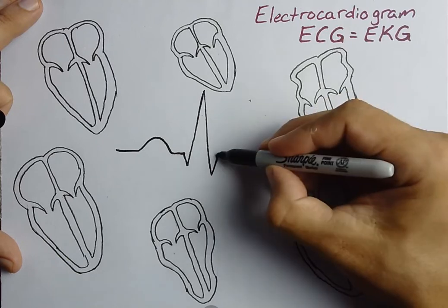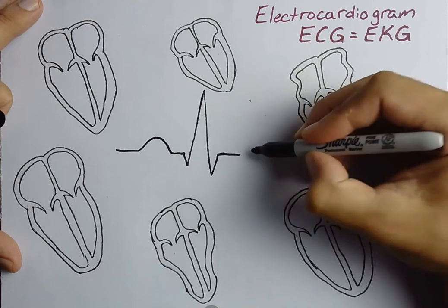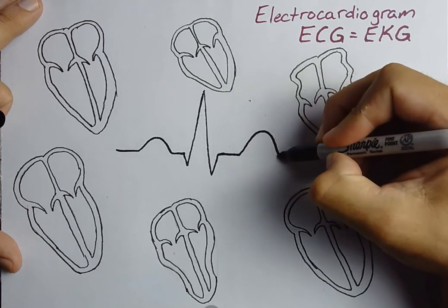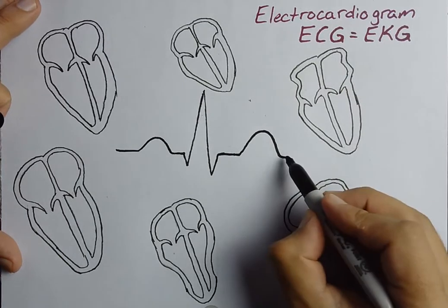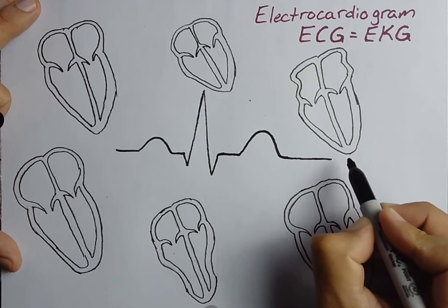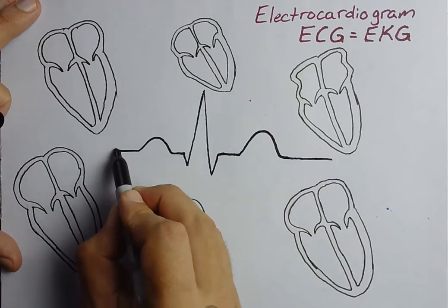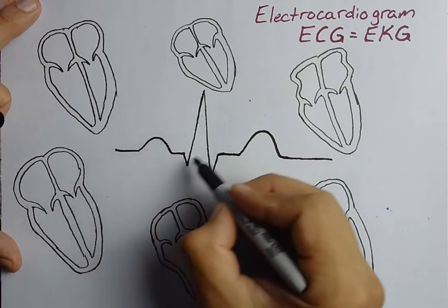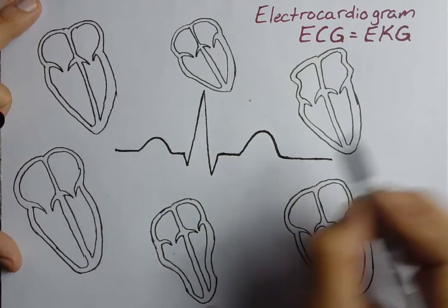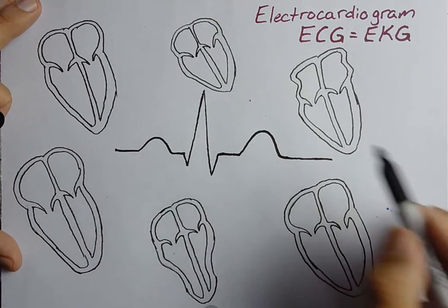Comes back up, flat lines for a little bit, and then has another hill. This hill is a little bit bigger than the first hill before having a flat line that goes for quite some ways. What's going to happen is that this point is just going to lead right back to this point, and it repeats the process again. This is the anatomy of an EKG, and I highly recommend just drawing it.